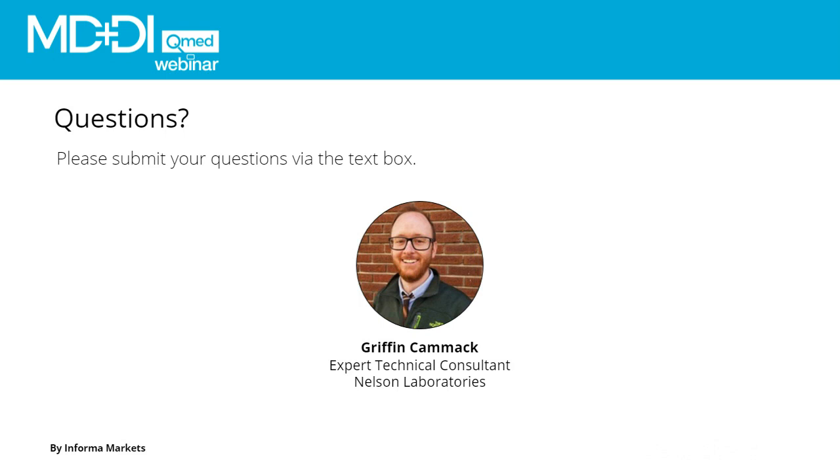Yeah, so great question. And again, I guess these are all great questions. I don't need to say that every time, but as I mentioned in my presentation, AAMI TIR12 does recommend that you use separate suspensions during your disinfection validation. And the reason for it is to ensure that there is no competitive inhibition with your microorganisms. So if you're following AAMI TIR12, it would say it's better to do separate suspensions because you're limiting that potential for competitive inhibition.